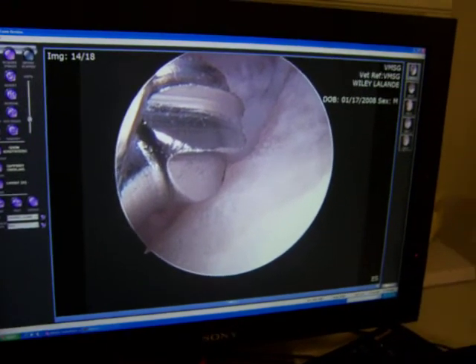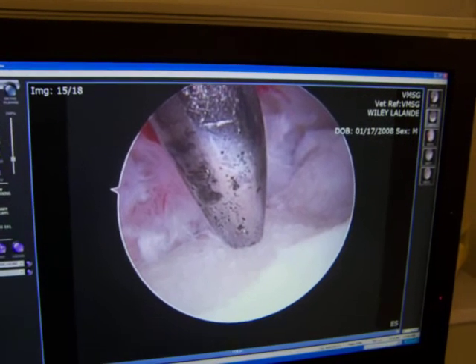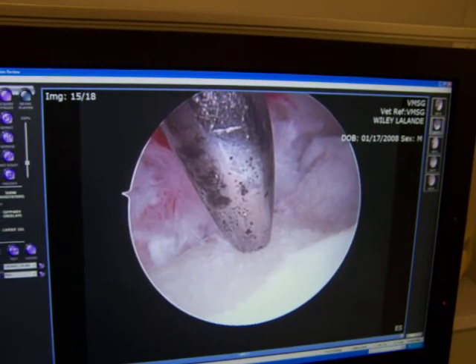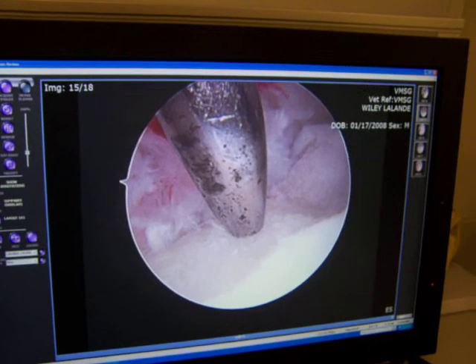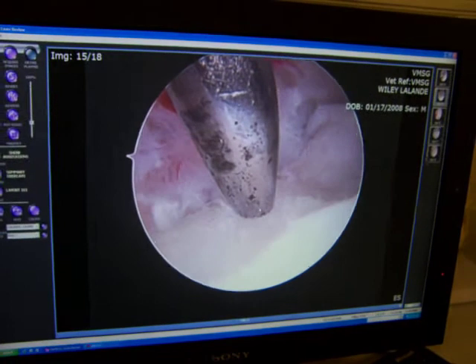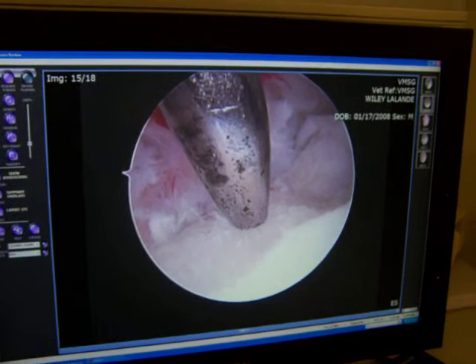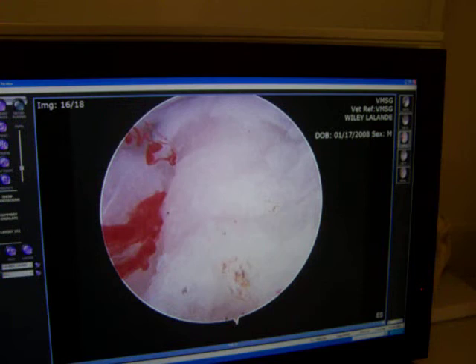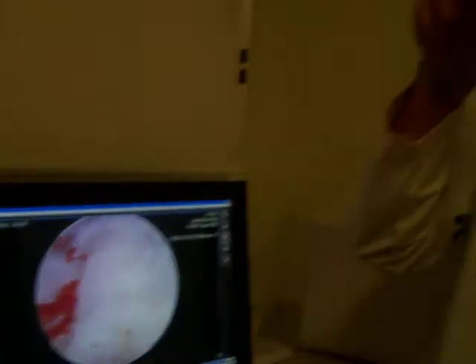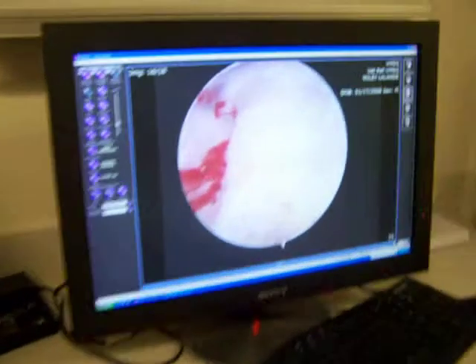This is the microfracture, or forage. It's interesting when you see it blown up like this — this is actually a smooth instrument. What I'm doing is drilling holes down into the bone, as we discussed, to allow new blood vessels and new stem cells to come up. It's a tight little joint. I put three perforations — boom, boom, boom — divided into thirds basically.